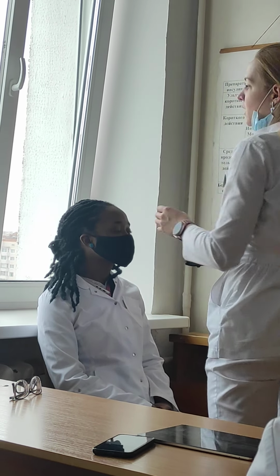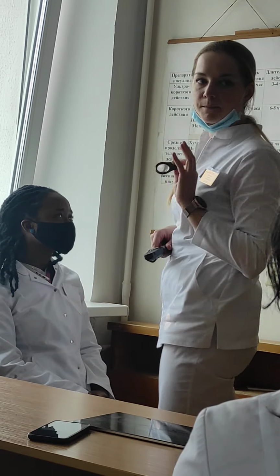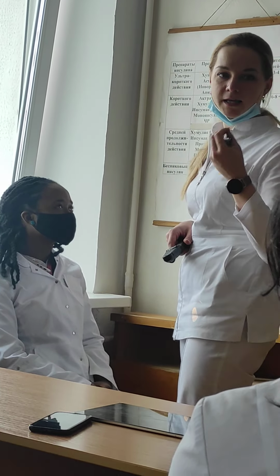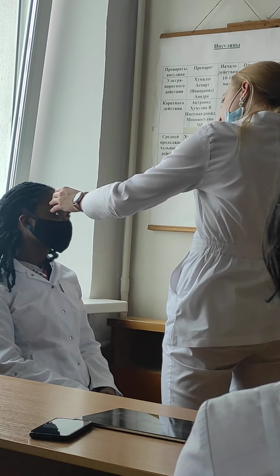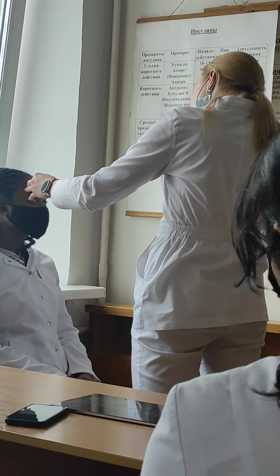After we check the optic nerve disc head and the periphery of the retina, we need to check the macular space. It is the less pleasant part because the light is too bright and the patient is not comfortable with that. That's why we do this in the last stage, asking the patient to look straight at the source of the light. And then we check the macula. So after we do that, we need to do the other eye.